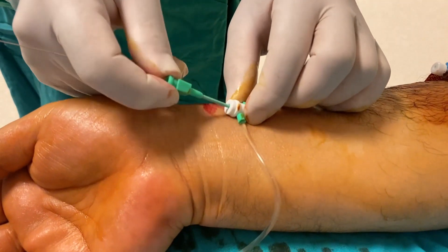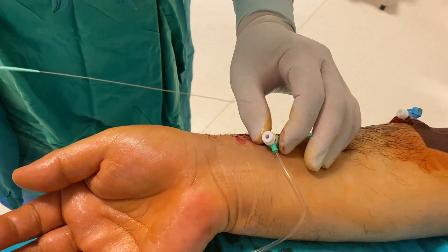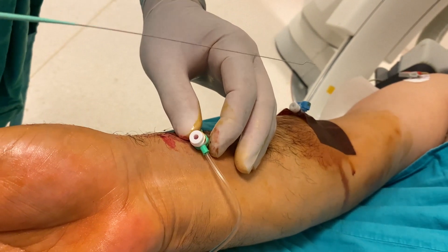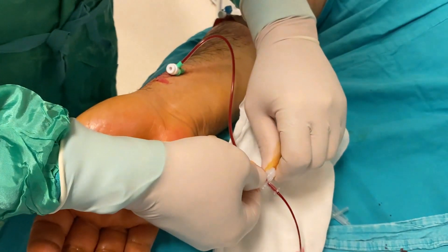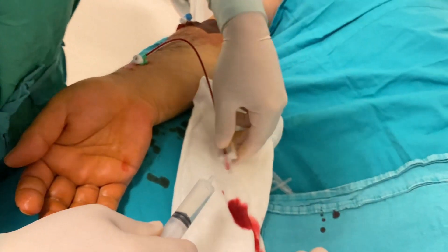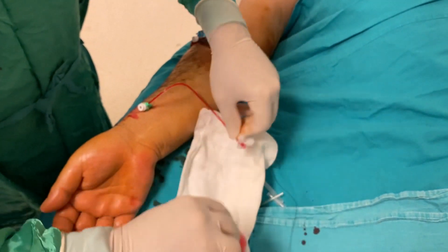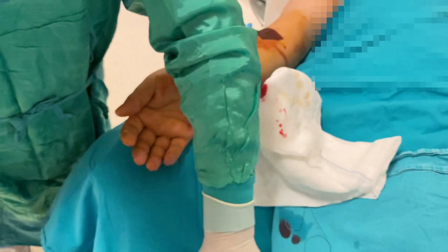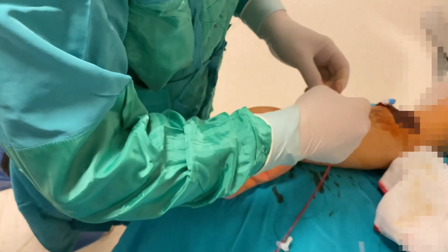Sonra içeride dilatör dediğimiz bir şey var; şu plastik, o dilatör. Bununla beraber bunu çıkarıyoruz. Bakın şit orada kaldı. Şu anda şitin ağzı plastik bir valv; içeri doğru gider, geri gelirken kan gelmez. Kanın geldiğini ve atar damarda olduğumuzu garantiye almamız lazım. Buradan açıyoruz ve kanın çıktığını görüyoruz. İçeri girdiğimiz kesinleşti, atar damardayız. Oraya şimdi damar yolunu yıkayacak heparin dediğimiz bir madde veriyoruz; hastanın kilosuna ve boyuna göre orantılı olarak veriyoruz. Kanama yapmıyor ama damar içinde dolaştığımız zaman pıhtılaşmayı da önlüyor.